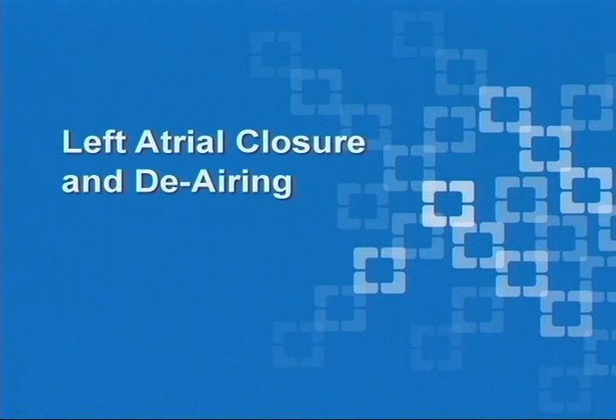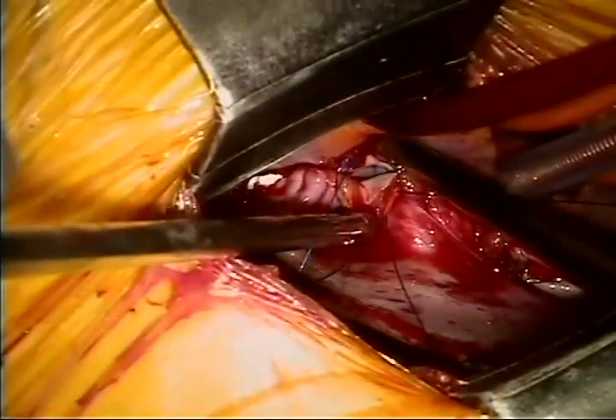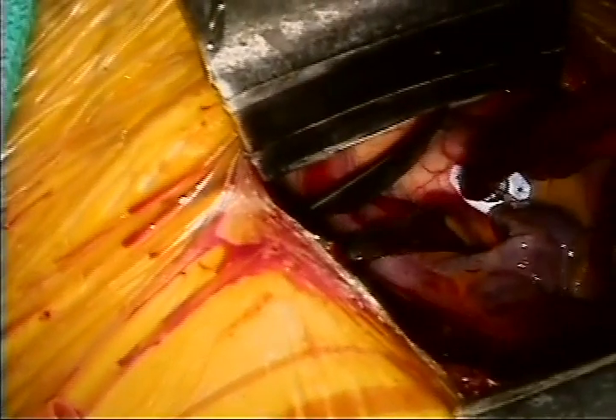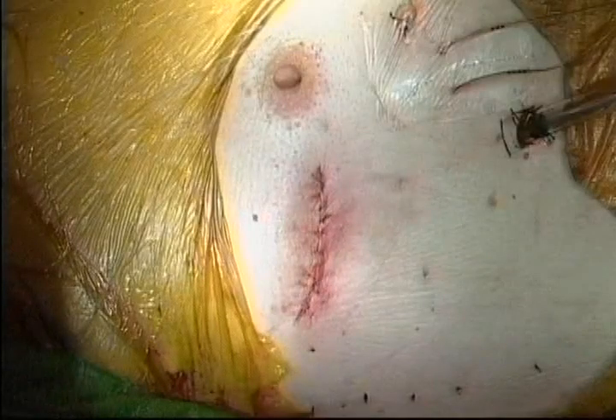After completion of the repair, careful left atrial closure and de-airing are essential. Long instruments and the Chitwood knot pusher facilitate closure of the left atrium. A standard running suture is used to close the left atrium, with a stitch begun at the bottom and a separate stitch begun at the top. Before tying the sutures together, the left atrium is de-aired by taking volume in the heart and inflating the lungs. A hot shot of cardioplegia is then administered and the aortic cross-clamp removed. The chest wall incision is closed in layers in standard fashion. A single chest tube is placed, and the On-Q pain system is placed in the intercostal spaces above and below the 6 cm incision in the 4th intercostal space.